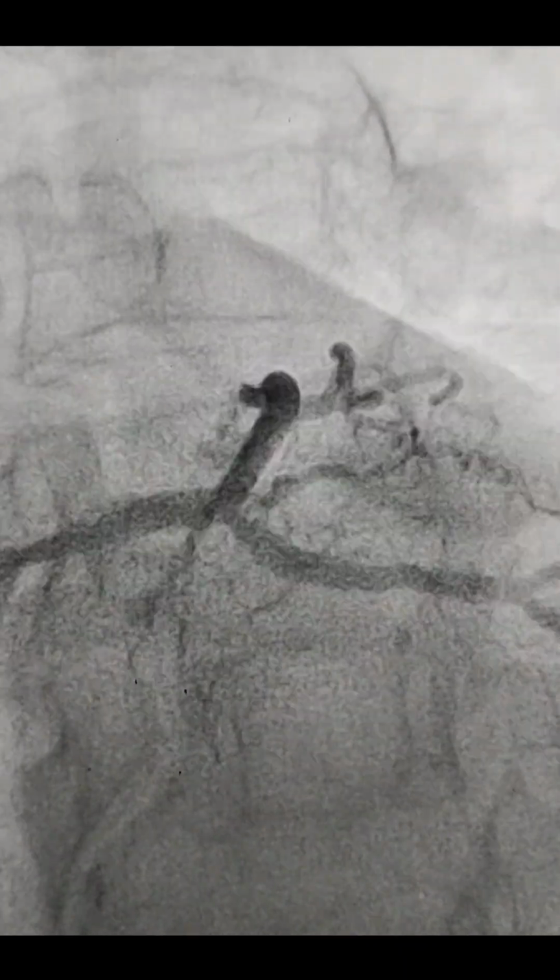So this was a PTCA to RCA, infarct-related artery, and then LAD with a complete revascularization in this 65 years old inferior wall ST elevation MI patient. The patient was stable, shifted to ICU.